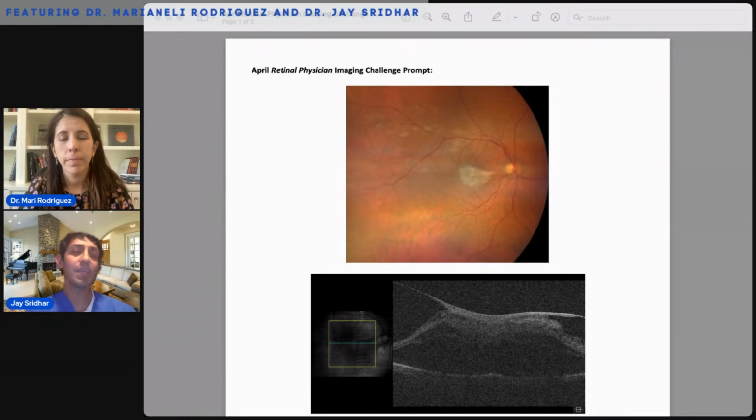For me, both have to line up, right? If I'm borderline, like this is a very obvious case where the vision is being affected. But if it's a borderline ERM and their vision's down and they have a cataract, I say, look, go get the cataract surgery. It's the quote unquote simpler surgery to have. And if you have that and you feel good, then great. You don't have to have that other procedure. I don't need to operate on you.